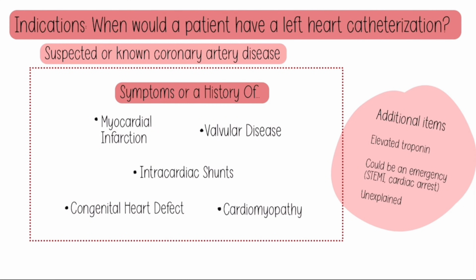If they had a positive stress test, to even correlate that a little further and say, you know what, let's take a look at this. Because remember, there is risk. This is an invasive procedure, so you do need to have some type of non-invasive indications or symptoms saying that this outweighs the risk of getting this invasive procedure done.